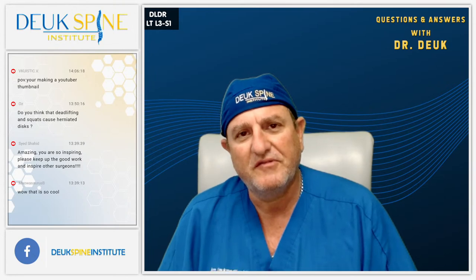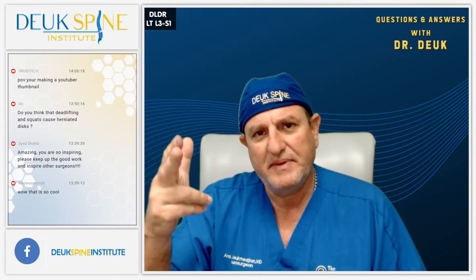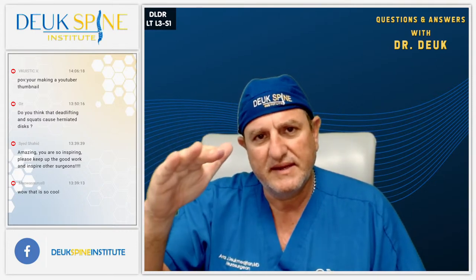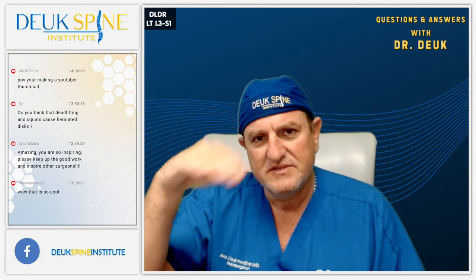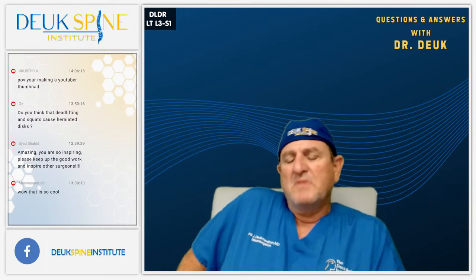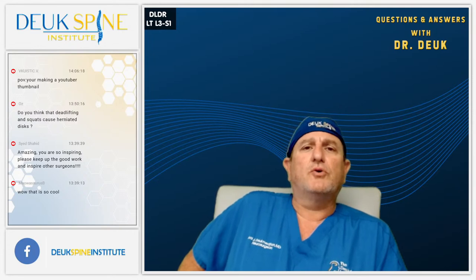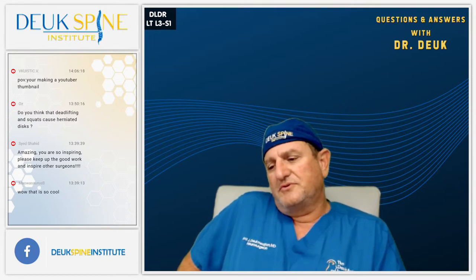We just completed a Deuk laser disc repair, left L3-4, L4-5, L5-S1. You could see in the beginning of the surgery, I tested all three discs and the guy had 10 out of 10 pain at L3-4, 9 out of 10 pain at L4-5, 7 out of 10 pain at L5-S1. So we confirmed that the discs were indeed the cause of his back pain. And more importantly than the numbers was the fact that the pain was concordant.